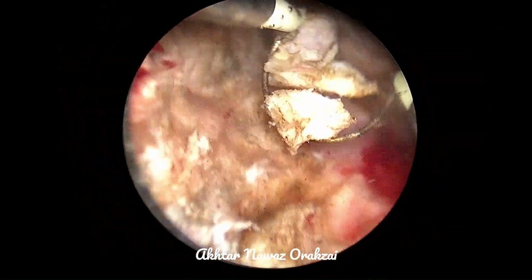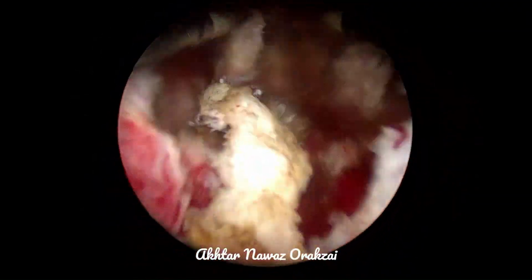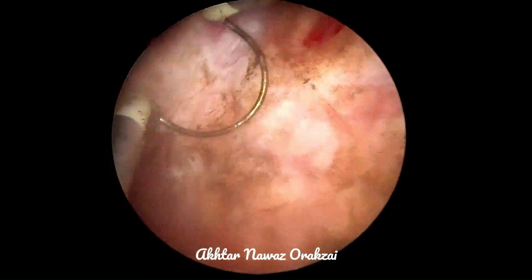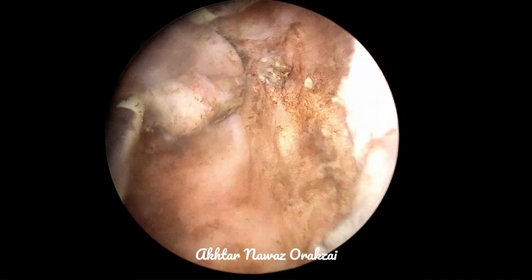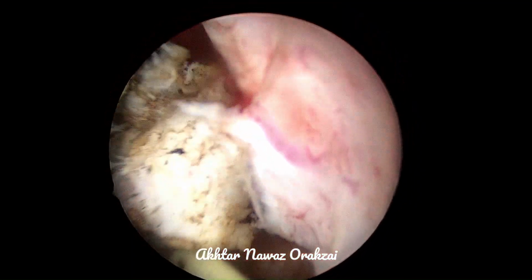However, when the bladder is emptied 2 or 3 times, the pressure in the bladder is reduced and more of the prostate pops up, which may lead to a smaller degree of relief, so lesser relief in the symptoms.